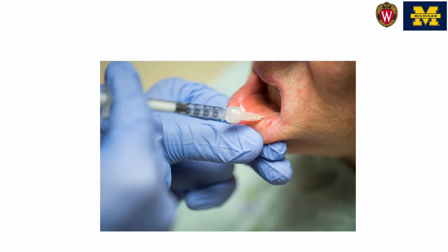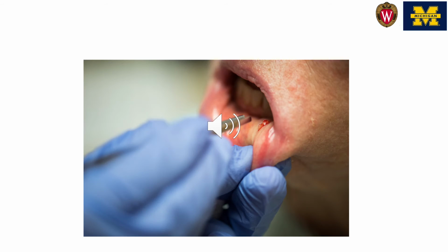The first thing we do is at that proposed site, we inject 0.4 milliliters of the lidocaine with epinephrine. And most of this epinephrine we want to keep superficial because the glands are very superficial as well. So I give a little bit deep, but mostly I put the medication very superficially where I expect the glands to be. I then allow the medication to dwell for 5 minutes, and I usually set up and do any notation during this time interval.